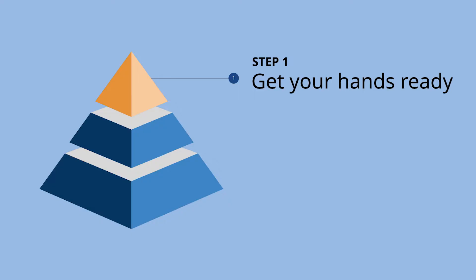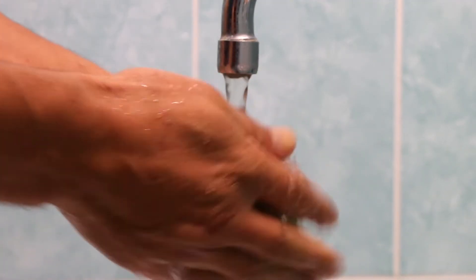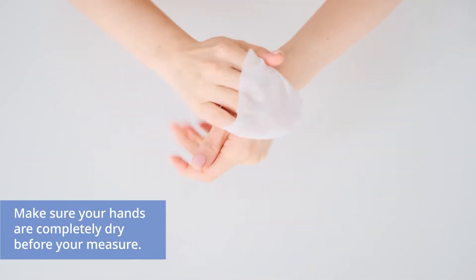The first step is to prepare yourself appropriately before you measure. Wash your hands thoroughly with soap and warm water. The blood sample you take is really small, so even hands that are just slightly damp can dilute the blood sample, making glucose seem much lower than it actually is. Make sure your hands are completely dry — either use a clean cloth or let them air dry.